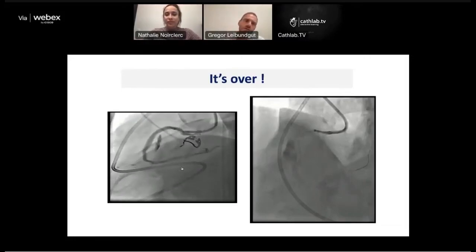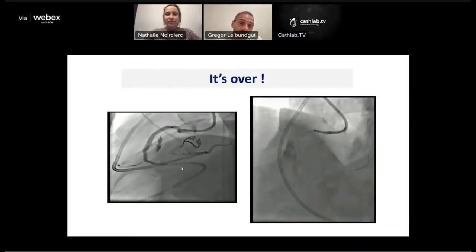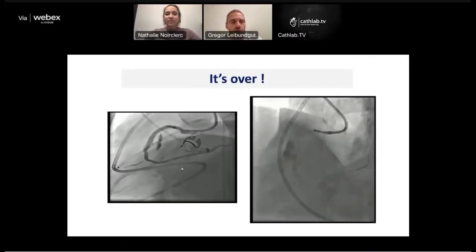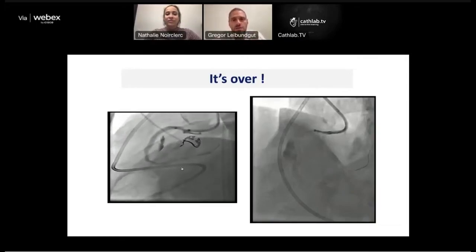If you are really sure that it's an endoleak, you can also, instead of placing another graft, because sometimes you don't have the grafts available, because you used up two and you only have two, and the third that you might need is not available, or the graft sizes are too small. Another thing I believe you must know is to what size you can overexpand your graft.